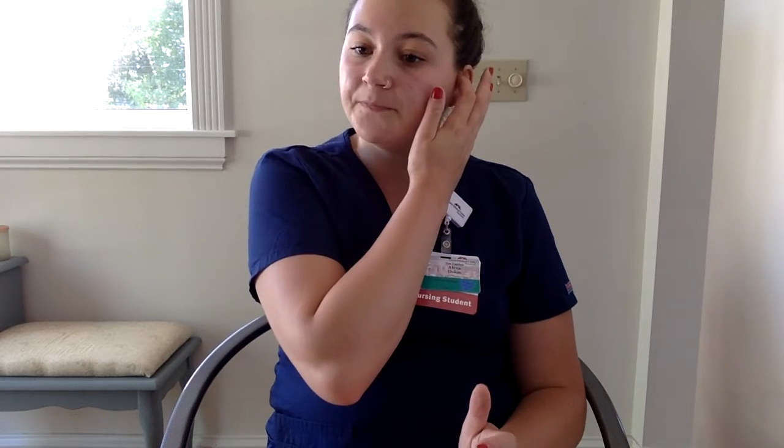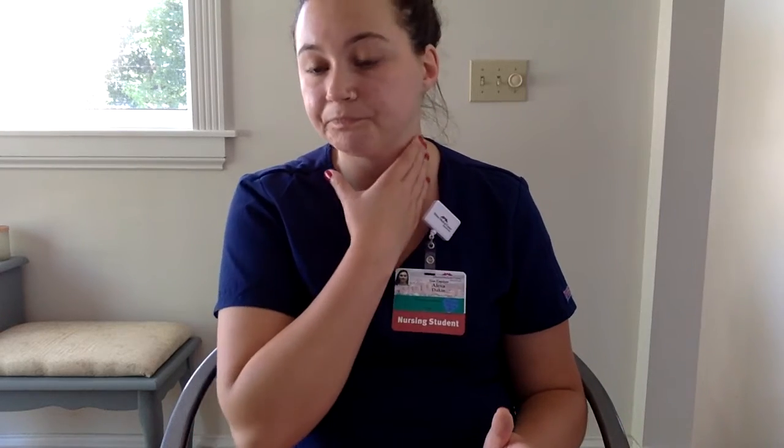So I see some orders have been placed that my patient is to be on a heparin drip for his diagnosis of PE. And so the first thing I'm going to do is just check and make sure that a baseline PTT has been drawn, because you can't start a heparin drip without knowing a baseline PTT. And I can see from my patient, Mr. Donald Scab, his medical record that a PTT has been acquired. So I know that his baseline PTT is 38, which is well below the range where it's appropriate to give this heparin drip. So I know that I can start this heparin based on the protocol.